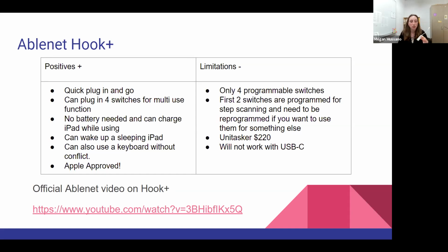And because they actually worked with Apple on this, it's developed to work with all the iOS systems. So it can actually wake up a sleeping iPad. If the iPad has gone to sleep, a student can hit their switch to actually wake up the iPad, which is nice. You can also use a keyboard without conflict because it is a direct hardwire into the iPad. You can still have a Bluetooth keyboard hooked up to the iPad working at the same time.